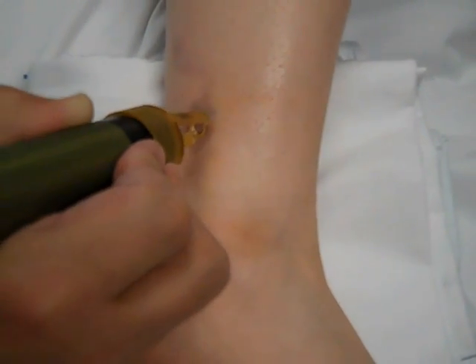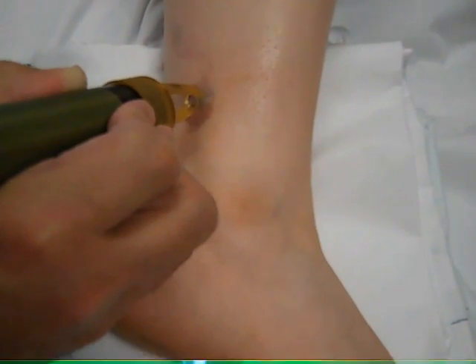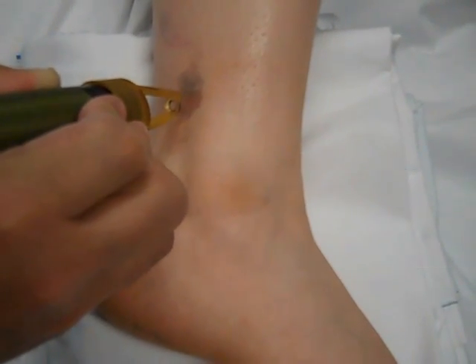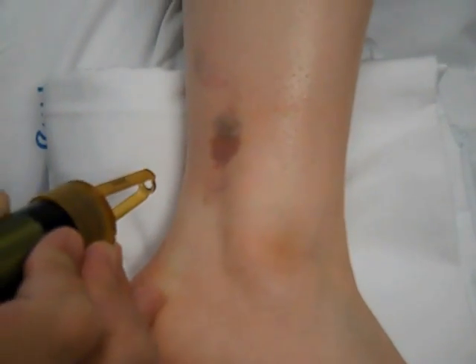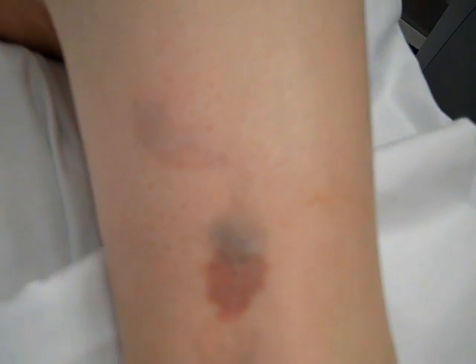Whereas sometimes you tend to get a little whitish discoloration as you treat with the Alex. With the YAG wavelength, it's usually more brown or red. Done. So this is pretty typical appearance after treatment with the two different wavelengths. A little more red, a little pinpoint bleeding from the YAG, not from the Alex.